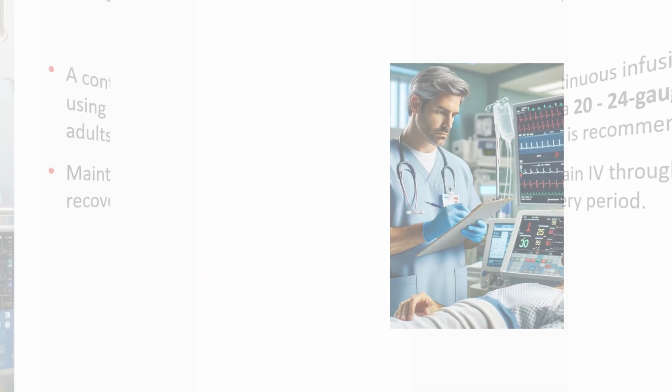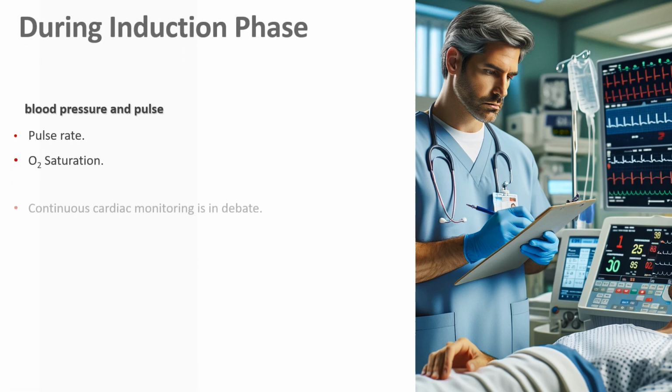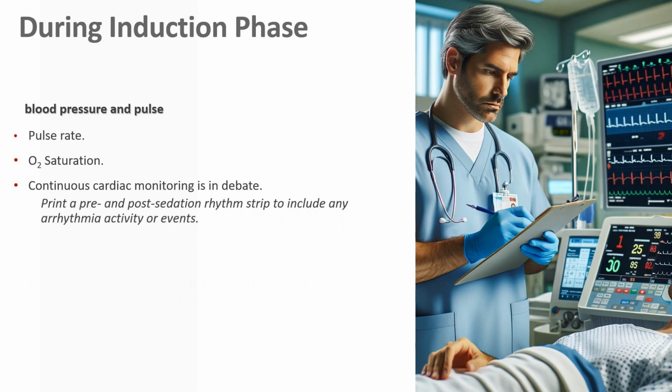Let's look at the induction phase, which means right before you're getting ready to start giving your sedation, you want to know what the pulse rate and O2 saturation are. Always document your baseline. Run a 6-second strip, just so if something does happen, you can say, this is what I had when I started. Over tens of thousands of cases, I've had twice in my lifetime that we canceled because of just doing that pre-check, because they had weird arrhythmias that nobody had picked up because there was no reason to pick it up.